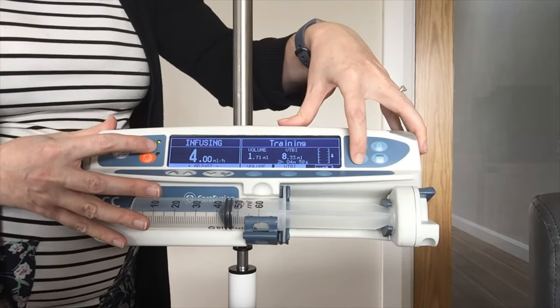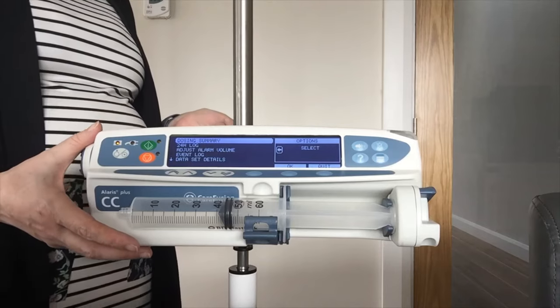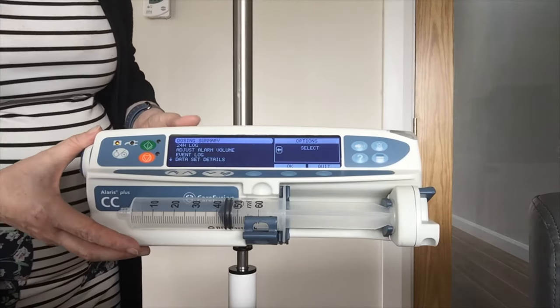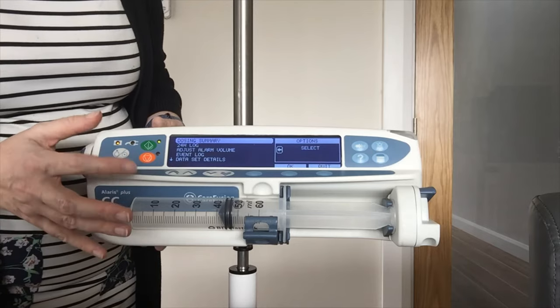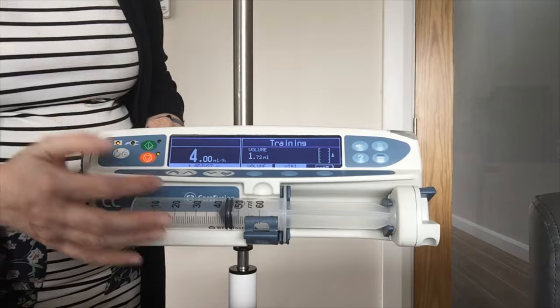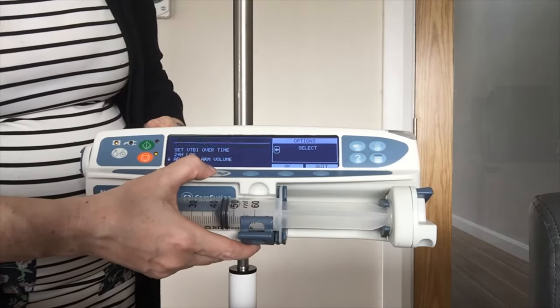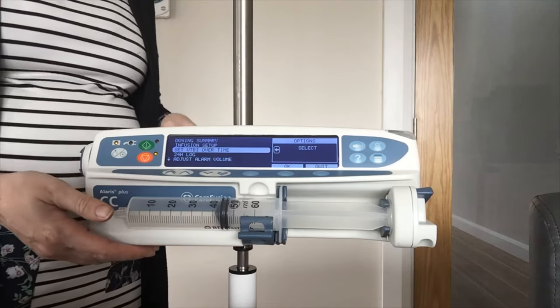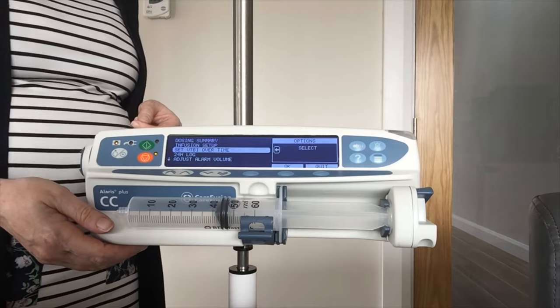Behind your options key — this is going to vary depending on how your pump is set up — but in there typically you will have your adjustable alarm volume, your event logs, and if your pump is on hold you can access the question mark menu. You may also have a drug library in there, or you have the option of volume to be infused over time if you need the pump to do the rate calculation for you.